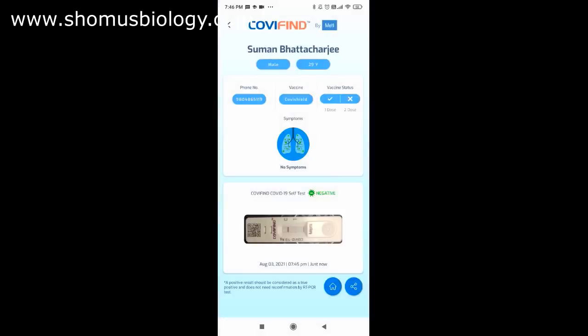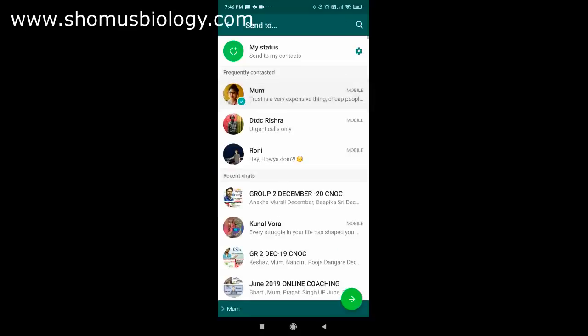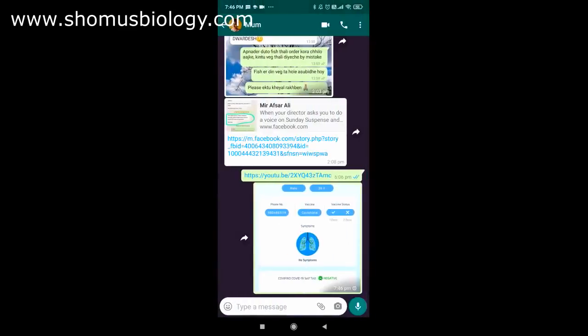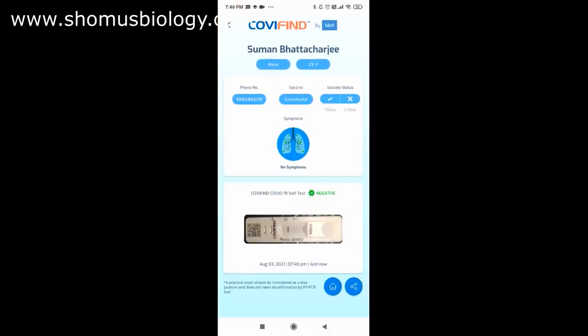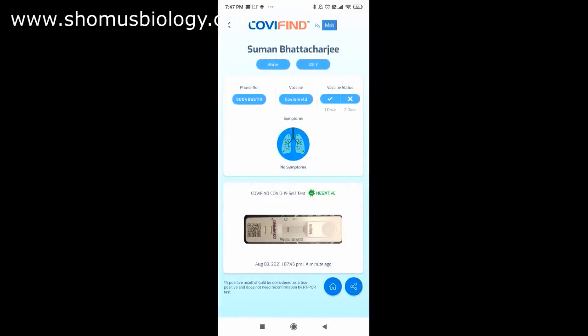The report shows negative. You can share this report by clicking the share button, which opens sharing options. The report page includes a picture of your cassette, your mobile number, vaccination status, and other details. Note: a positive result should be considered a true positive and does not need reconfirmation by RT-PCR. You can always go back to the history to check previous test reports.